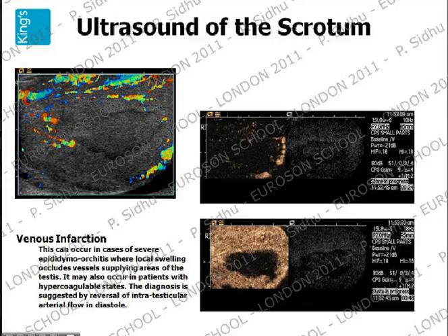And you may get some very indeterminate-looking lesions like this, which when you inject contrast have no vascularity at all. It's probably a venous infarction, but you can't be absolutely sure that you're not dealing with an abscess within the testes, but that is less likely, because I want you to look at the surrounding enhancement there. There's no increase in enhancement as you would expect in an abscess.